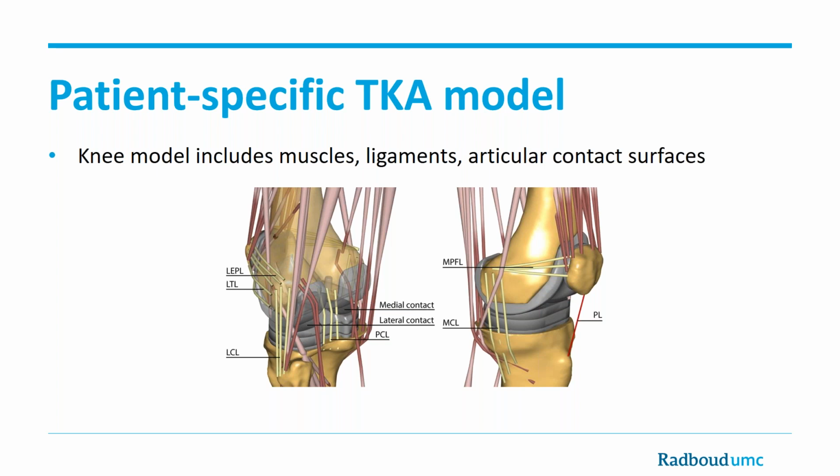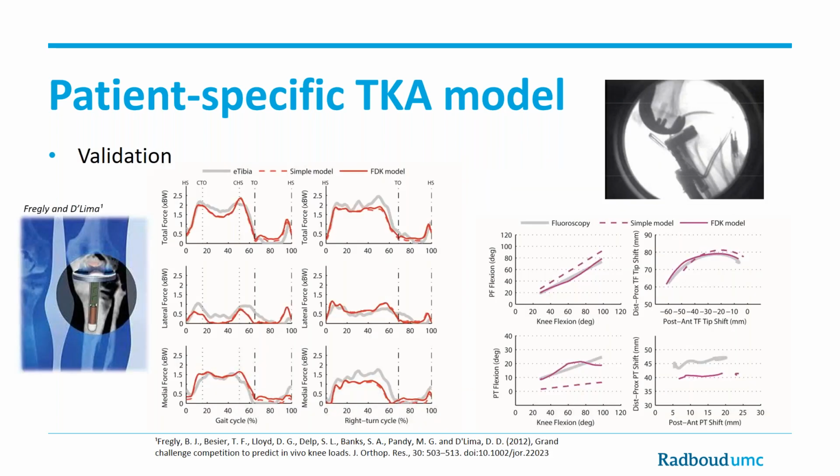Thanks to the use of a technique called force-dependent kinematics, we are able to simulate the biomechanics of the model all at the same time in the same simulation. So we validated this model using experimental data sets from the Grand Challenge competition, and this gave us a great amount of confidence because the estimation of tibiofemoral forces was pretty good. And we could also validate the sagittal plane kinematics using single plane fluoroscopy provided in the same data set.